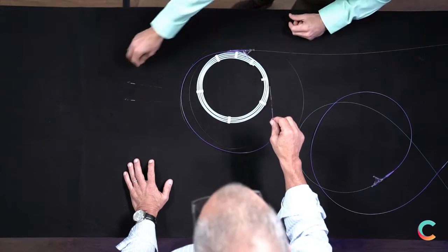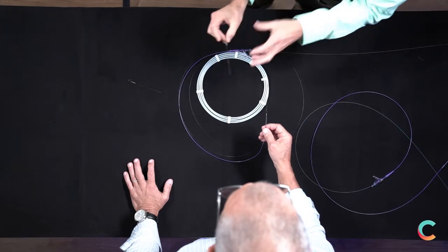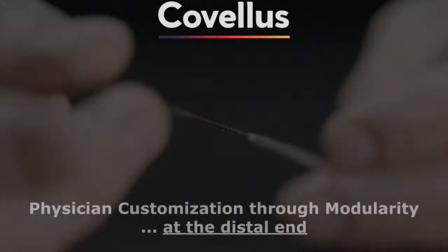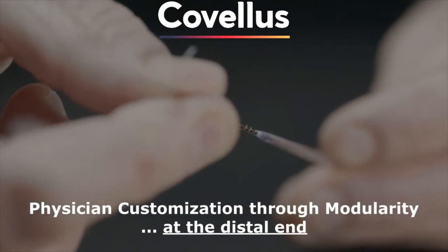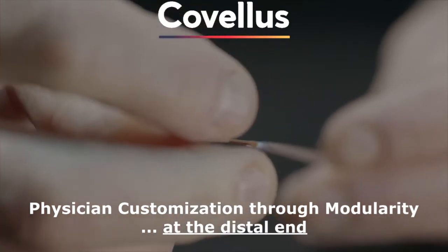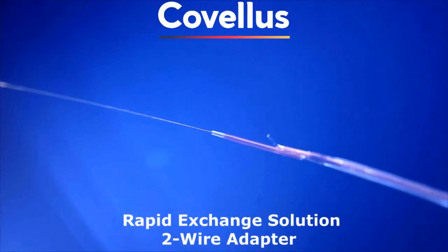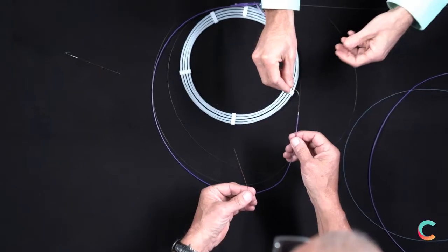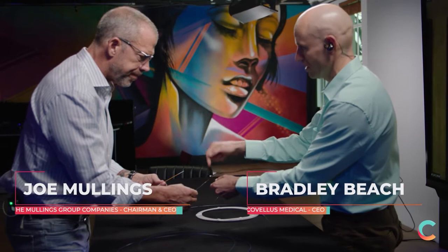But the idea is you can take these smaller adapters, and there's a unique way to couple the two things together so that it's one way, it's secure, it's reliable, it's robust, and it's not going to come apart. And now you've added the feature. In this case, it's a very simple feature. You've just added a secondary lumen so that now the physician can use two wires at the same time. One is through this rapid exchange, using rapid exchange techniques, but you still maintain the central lumen.